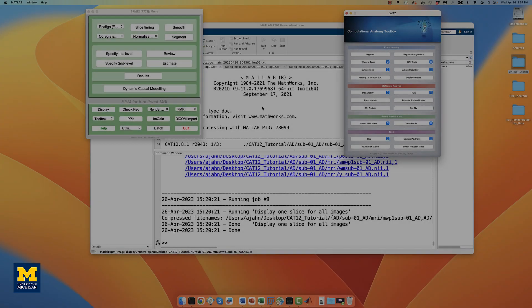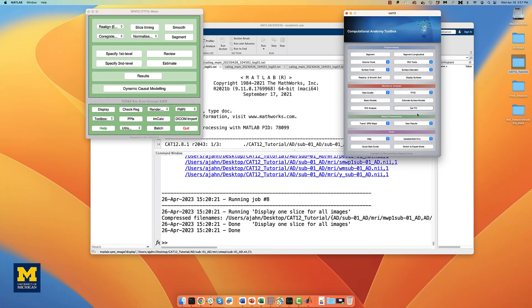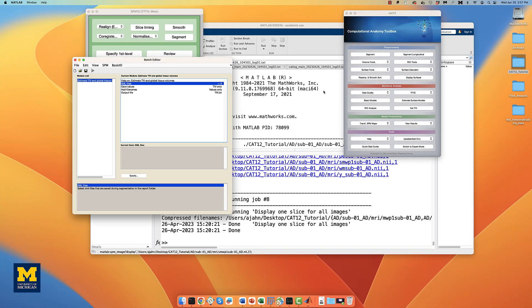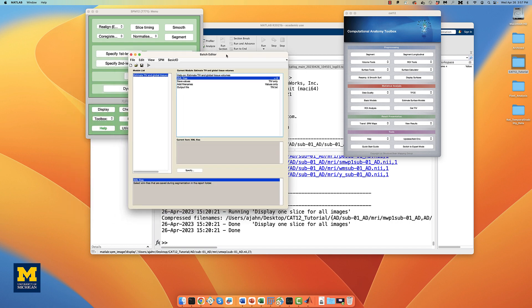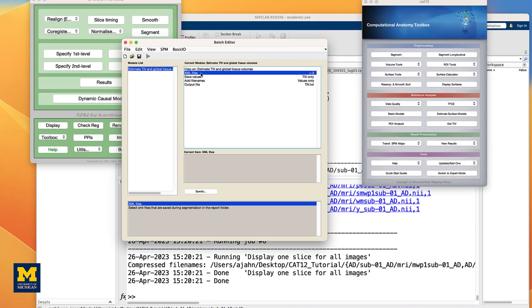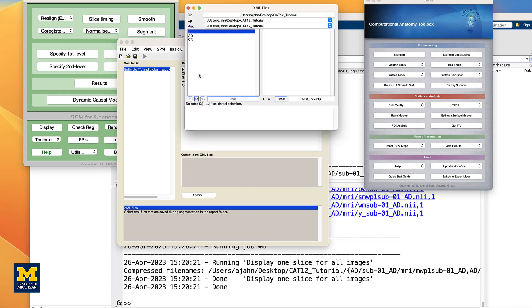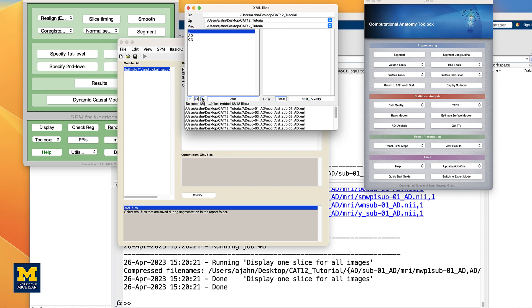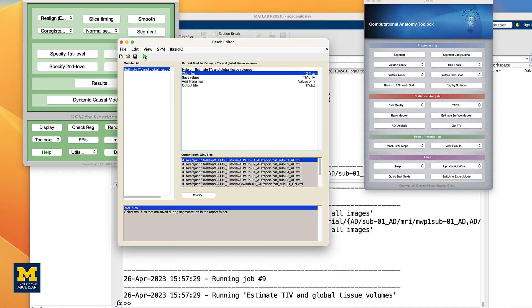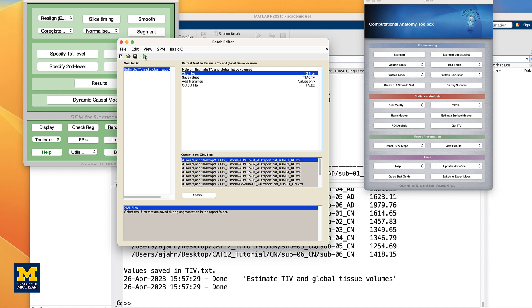To extract these measurements into a single text file, from the CAT12 GUI, click on Get TIV. Double-click on XML Files, and note that the filter is already set to detect .xml files. Click on Recursive, and it should pop you at the lower window with 12 files, one for each subject. Click Done, and then click the green Go button.